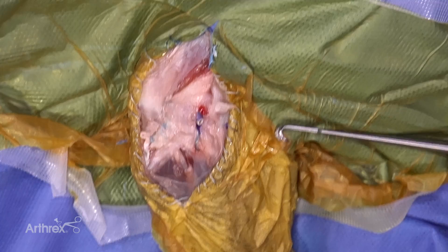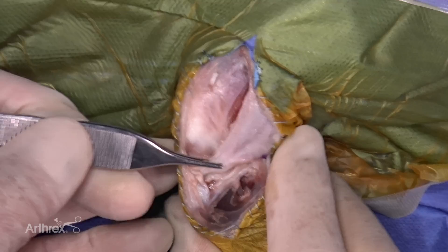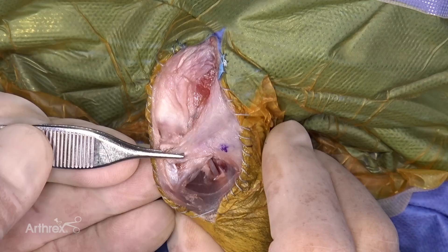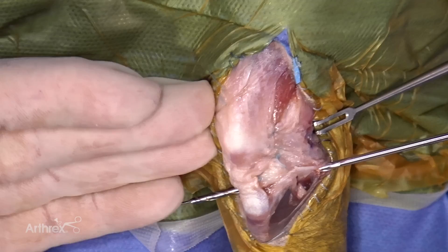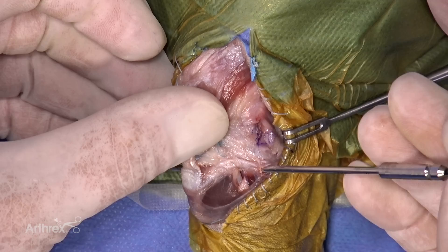From here you would close the fascial incision, then subcutaneous tissue and skin. The first technique demonstrated was the knotless technique. Now we're going to show the knotted technique.